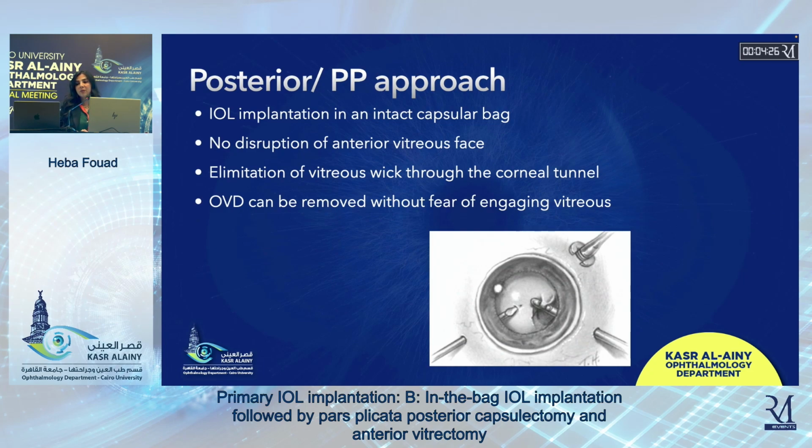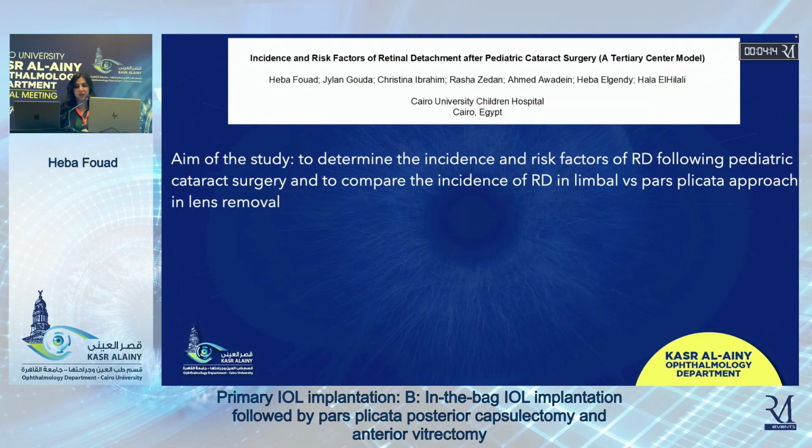In the posterior or pars plicata approach, the IOL is implanted in an intact capsular bag. There is no disruption of the anterior vitreous face, and there is elimination of vitreous wick through the corneal tunnel, and the OVD can be removed without fear of engaging vitreous.